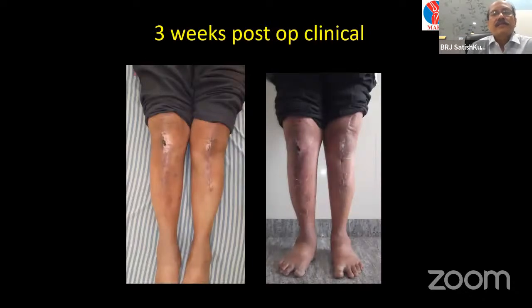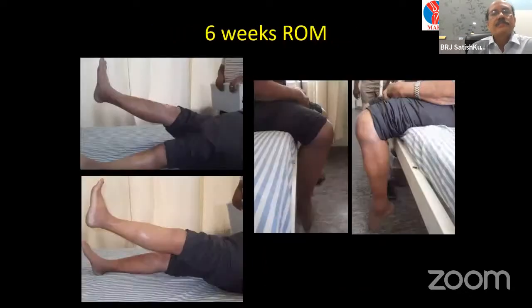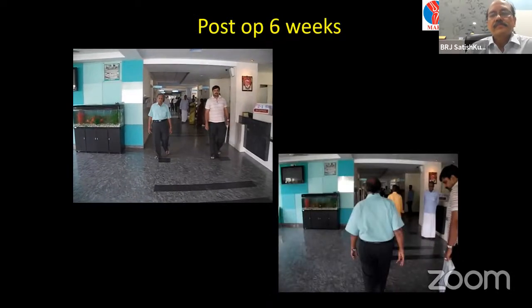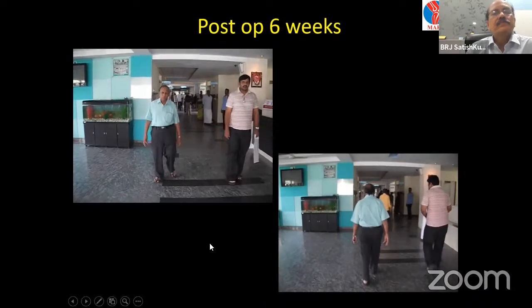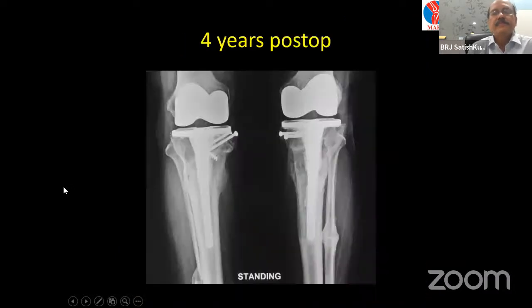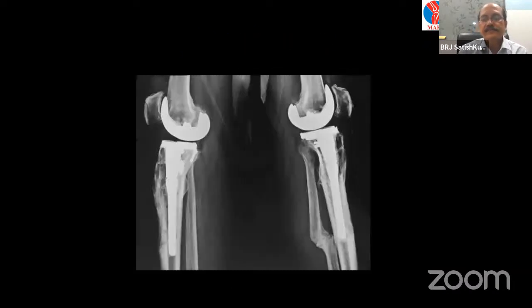You can see the excellent deformity correction, 3 weeks post-op, and this is 6 weeks. And this is 4 years follow-up. So you can see excellent incorporation of the graft, and the deformity correction is maintained.